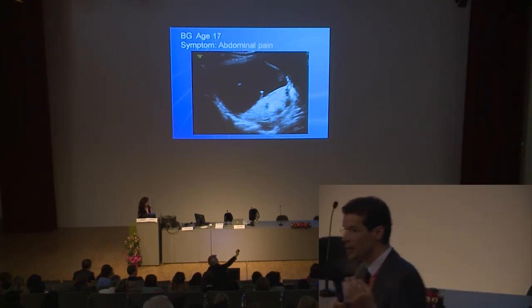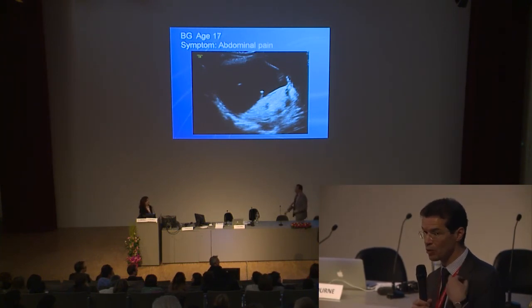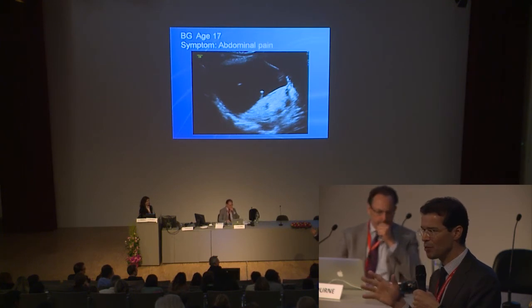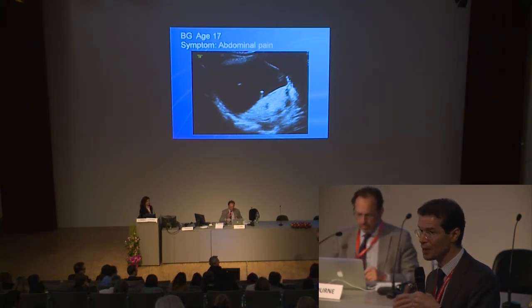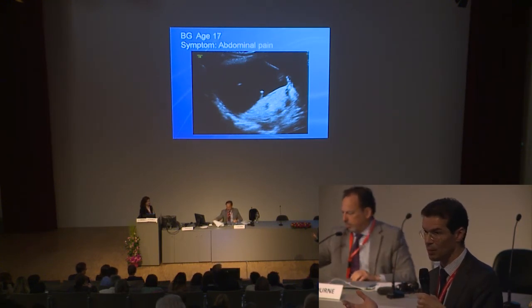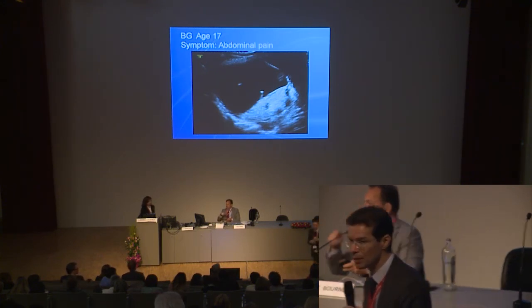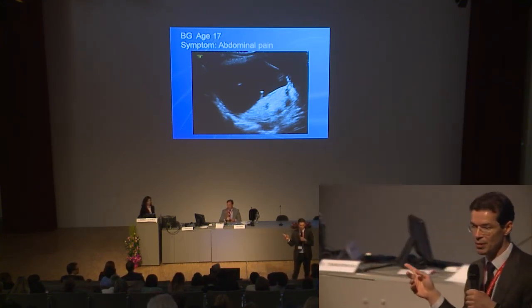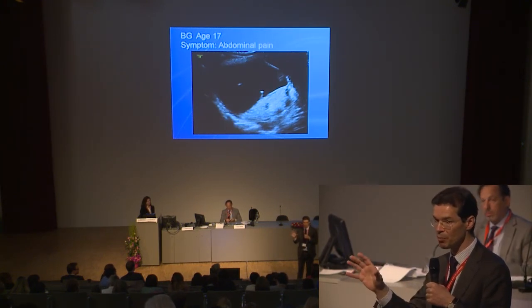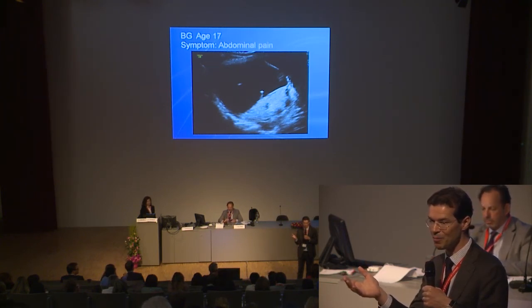And then you can say, what I write very often is, I think it's this, but I cannot exclude the presence of malignancy. And if your model tells you there's a 50% risk of malignancy, then I would certainly say, beware, because the model predicts that there is a good chance of a malignancy, 50%. And the model is well calibrated, as we've seen yesterday, so this is a real risk. If you have 100 patients with this profile, 50 will have a malignant tumor.